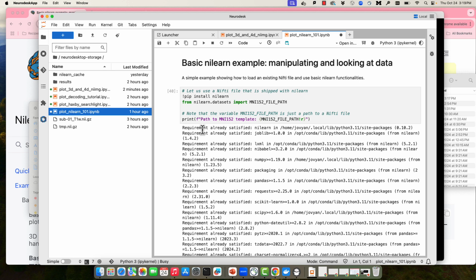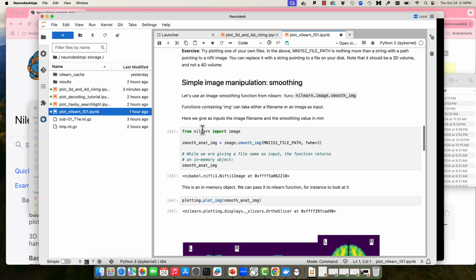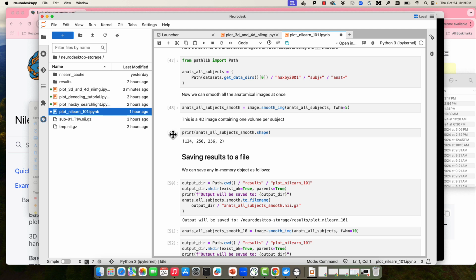Again, if it gives you an error with Nilearn, just add that code and run the whole thing again. But the point is, everything went by very quickly, but everything did run. You may have noticed anytime something is actively running, taking time, the number next to the cell turns into an asterisk, meaning it's still processing.